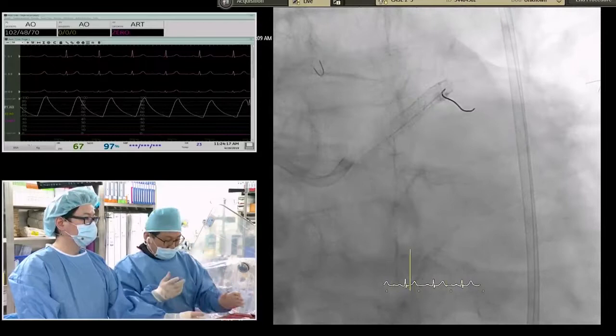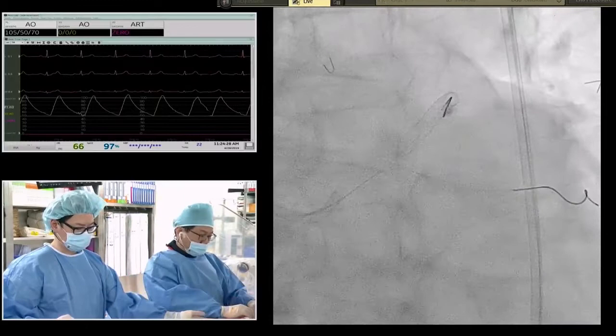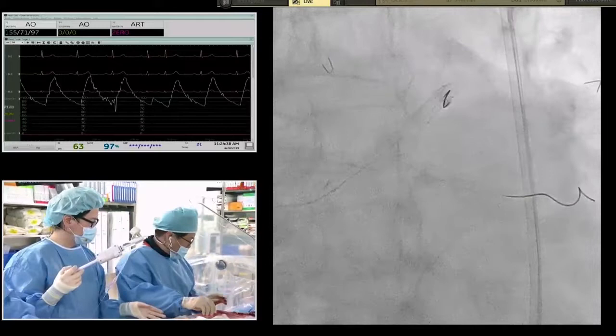Nice. And then, yes. The ostium of the circumflex is so heavily calcified that it's going to be very difficult to get a good MSA. Yes. Yeah, right. 3.75. So, yes? Excellent job. You have 6 minutes left. Please keep going. Okay. We have a 10-minute lecture after you.